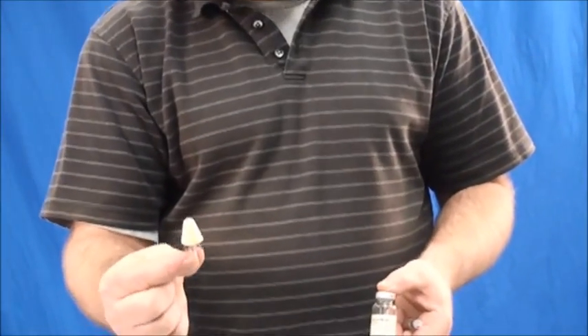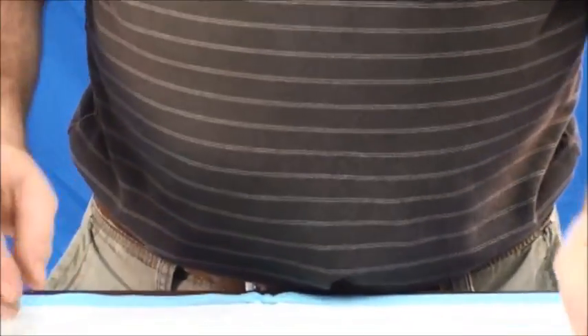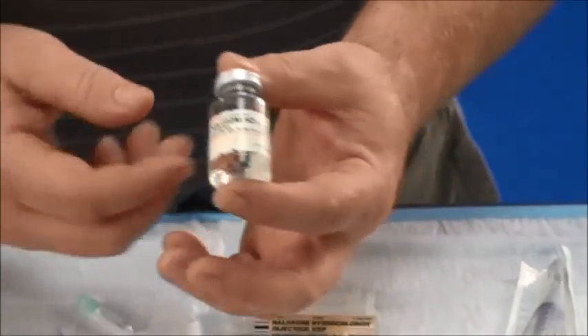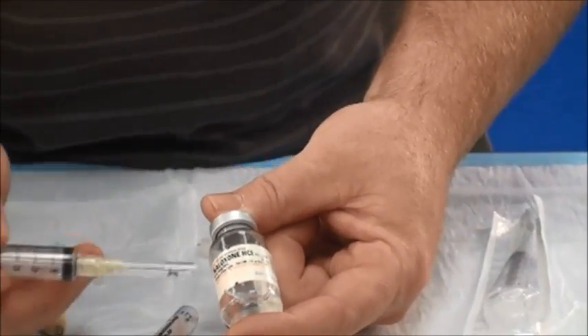Now I'll demonstrate how to deliver Narcan or Naloxone for North Carolina EMTs through a nasal atomizer. First, we want to make sure we're using the correct drug, so we're going to do our five patient rights, but let's take a look specifically at the Naloxone here.